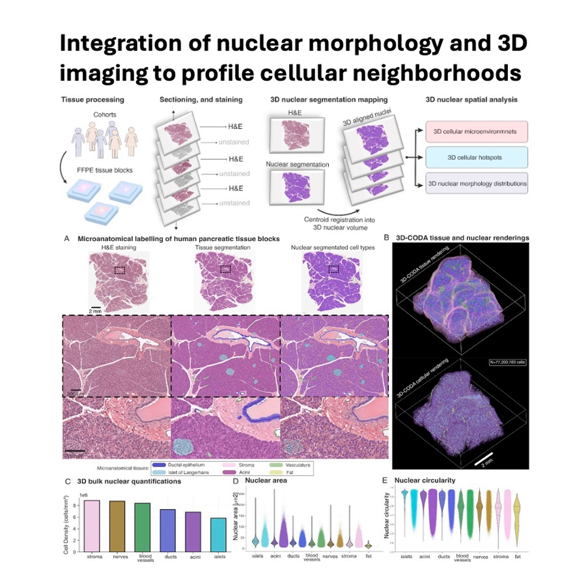It sounds incredibly promising, but technology like this never comes without challenges, does it? What are some of the current hurdles? You're absolutely right. It's not trivial. One huge challenge is just the sheer computational demand. Processing 77 million nuclei in 3D. Exactly. Segmenting them, extracting features, analyzing the spatial relationships for millions, potentially billions of cells in larger samples. It requires serious computing power, robust hardware, very efficient algorithms. That's a significant bottleneck right now. Makes sense. Data overload? Anything else?